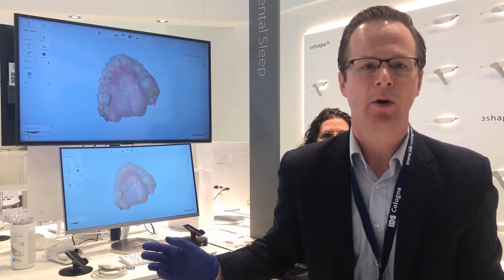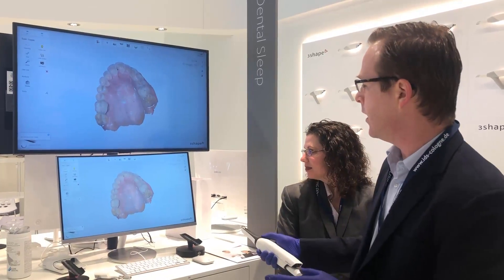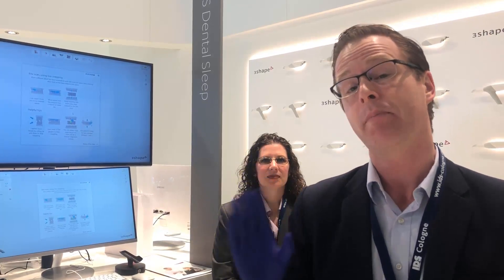I'm at a trade show here in IDS Cologne, and I scanned my patient's maxillary arch in approximately one minute. Just for fun, we're going to simulate doing an occlusal device with the Splint Design software in Splint Studio within our Trios ecosystem. I'm going to scan at an open bite vertical. As a prosthodontist who does a lot of occlusal guards and rehabilitations, that's a huge important factor for me.